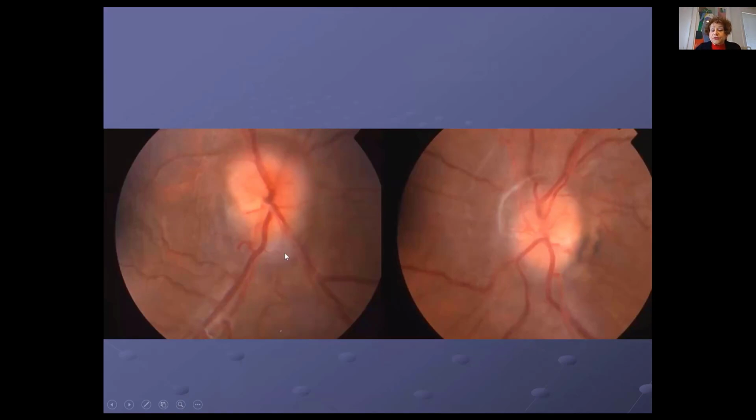And not only are they swollen, but if you're very observant, you will appreciate that she has these light-colored striae over here that we call Paton's folds. She has an epipapillary membrane here, which has no significance, but both discs are very swollen.